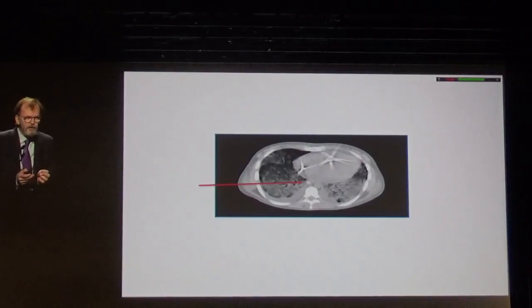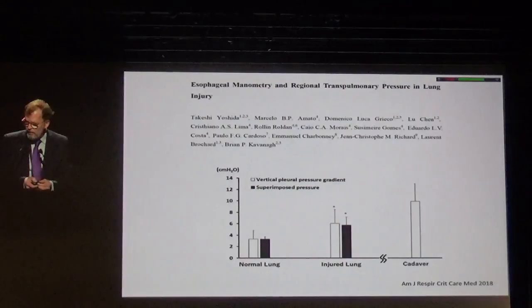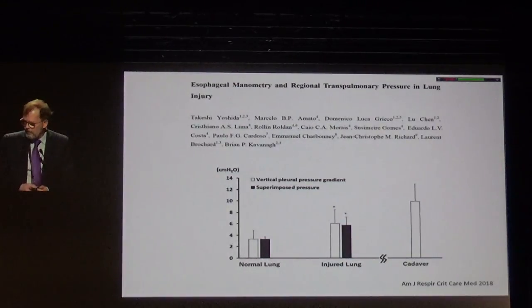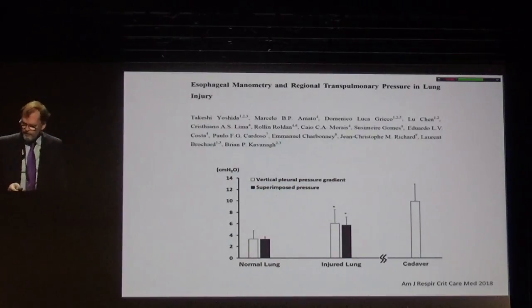And to be really sure of that, we did a really large collaborative study. Some part of the measurements have been done in animals, other have been done in cadavers, other have been done in patients with CT scans. Some studies have been done in Sao Paulo, Brazil, some have been done in Toronto, some have been done in Quebec. So we put all our efforts together to try to definitely answer what are we measuring with the esophageal pressure.